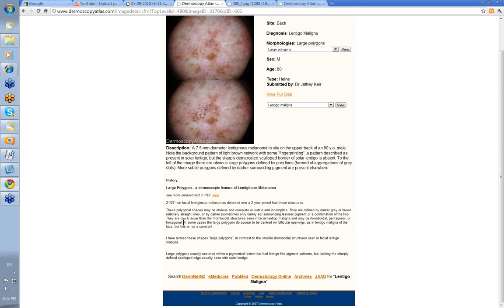Polygons are much larger than the rhomboidal structures seen in facial lentigo maligna and may be rhomboidal, pentagonal or hexagonal. In some cases these large polygons do appear to be centered on follicular openings as in lentigo maligna of the face, but this isn't constant. Large polygons usually occurred within a pigmented lesion that had lentigo-like pigment patterns but lacking the sharply defined scalloped edge usually seen with solar lentigo. Notably, 21 out of 27 non-facial lentiginous melanomas showed this feature of large polygons detected over a two-year period in his practice.